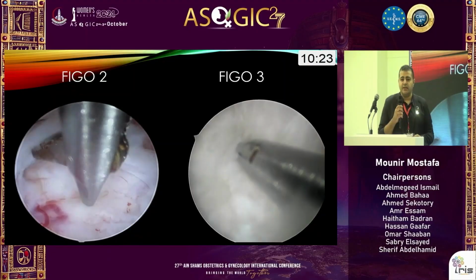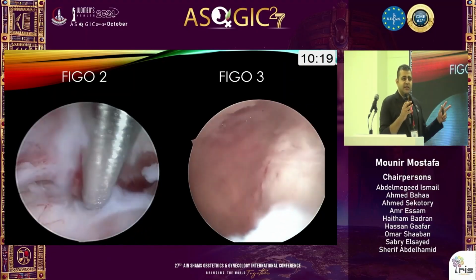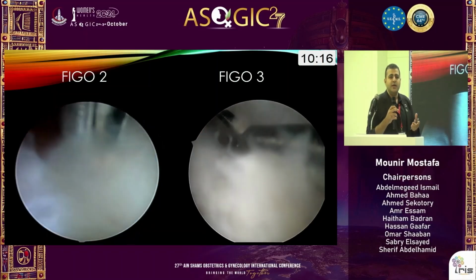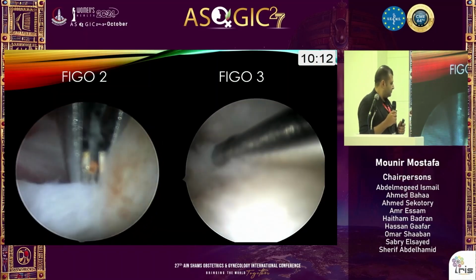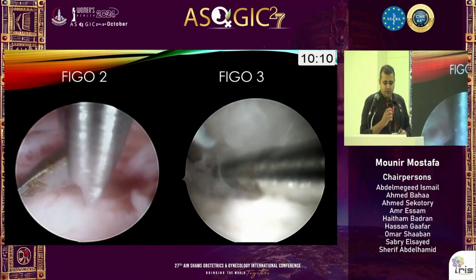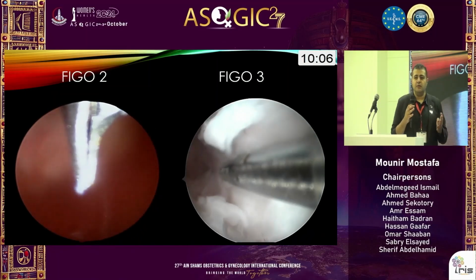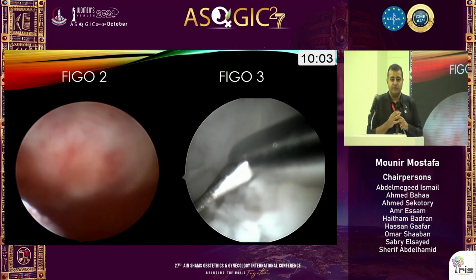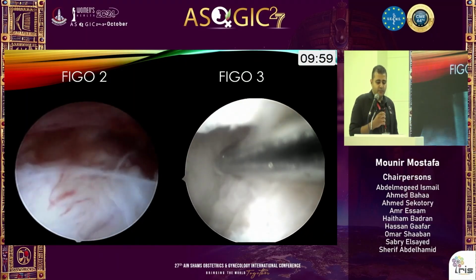That's why it's called tackling. We are trying to dislodge the myoma. I'm not trying to cut the myoma. We won't start resection now. You have to move the myoma at least to FIGO 1. We'll have here some special management for the fluid and operative preparations. I'll show you later. The operation can take a long time.